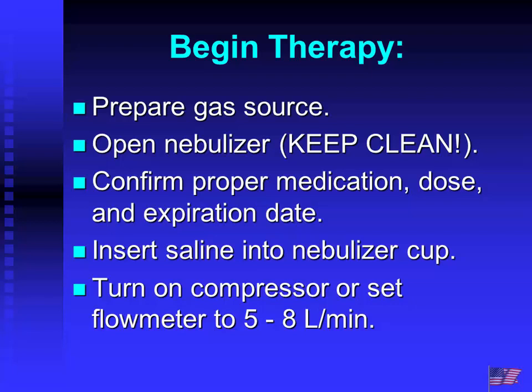Prior to therapy, we want to make sure we have our gas source that's functioning. We're going to keep the nebulizer itself in a clean fashion so that we're not contaminating it, especially the mouthpiece. Make sure the medication is the proper medication, proper dose, that it's not expired. Go ahead and insert the saline and the medication into the nebulizer cup and set our flow to somewhere between 5 to 8, whether we're using a compressor or we're using a flow meter.